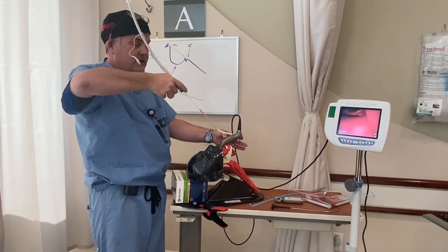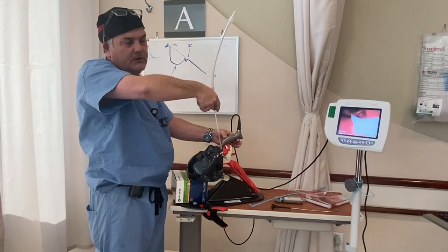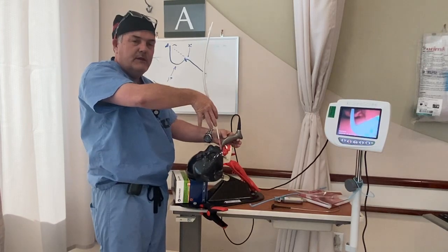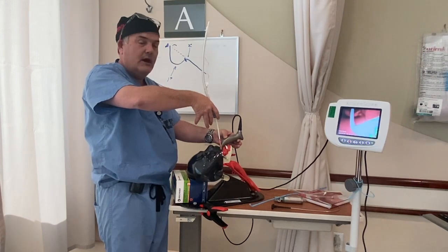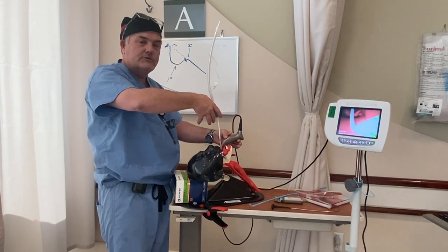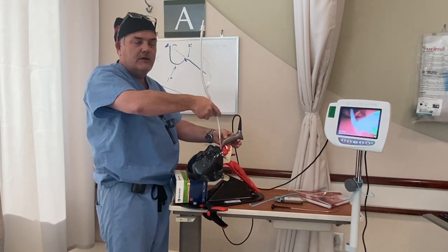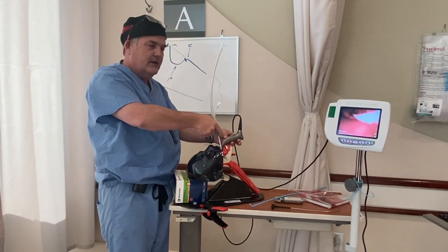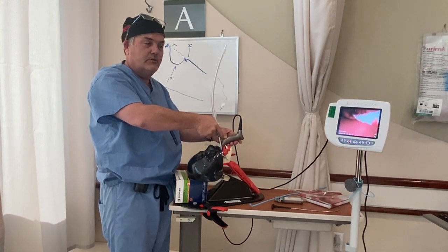Visualization right around that primary curve requires very little force. Access is now dynamic and steerable — we see the tip come up anteriorly and seat at the cords. I ask residents to push gently; it will not go down the trachea because of that anterior orientation. We need to solve the inflection point between the anterior and posterior curves, so I have them pull the trigger to move the tip down — and suddenly the device dives into the trachea. That's the aha moment: they've experienced the inflection point and the secondary curve.